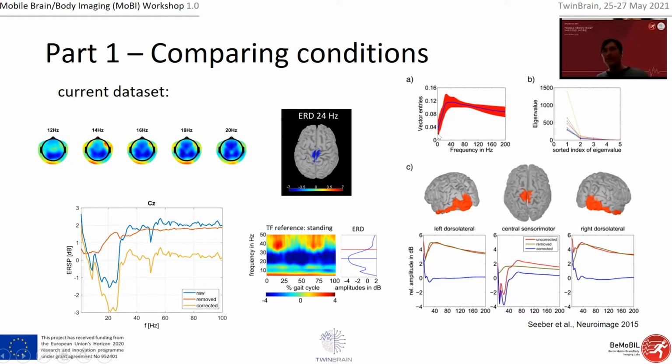There's a spectral profile for the artifacts that is very characteristic, and very similar to the one we showed here. If you compare those two in the central sensorimotor regions, it is very similar to what is in the paper, and this is exactly what we can reproduce in the data set you shared. That's quite encouraging because we see the same phenomenon showing very similar characteristics.